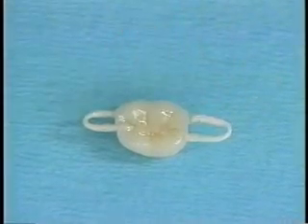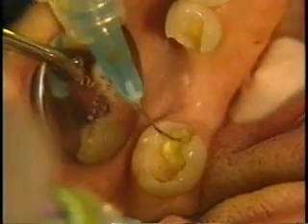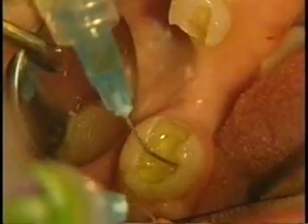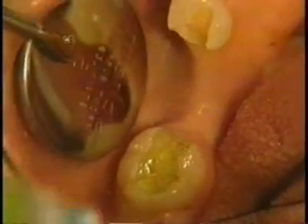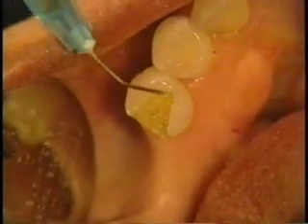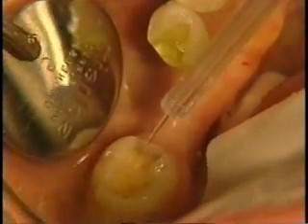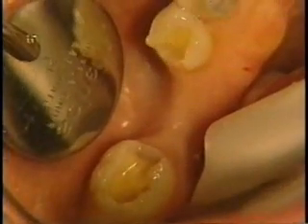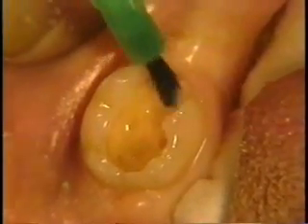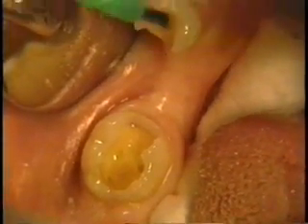The internal surfaces of the preparation are etched with phosphoric acid for 15 to 20 seconds and thoroughly flushed with water. After placement of a universal dental adhesive, the internal surfaces of the channel are coated with a thin layer of clear, unfilled resin and polymerized with a curing light.